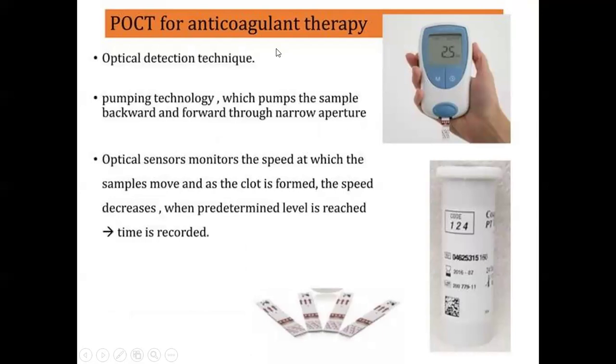This is for the anticoagulant therapy. This device is similar looking to the glucose one. So you can check whether the clot is formed or not. Keep one drop of blood, and how long it takes can be checked, so you can see how efficient the anticoagulant therapy will be on certain patients.